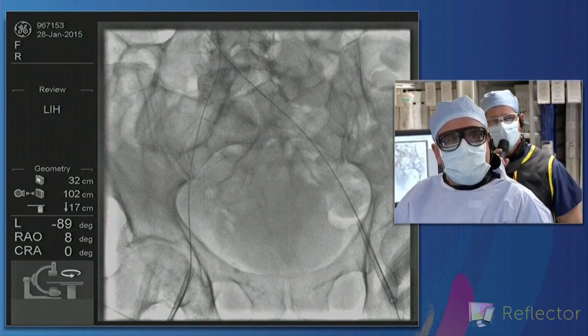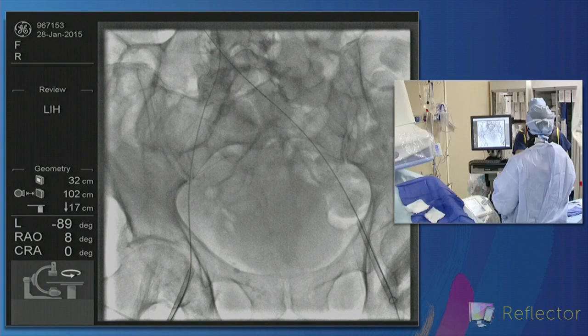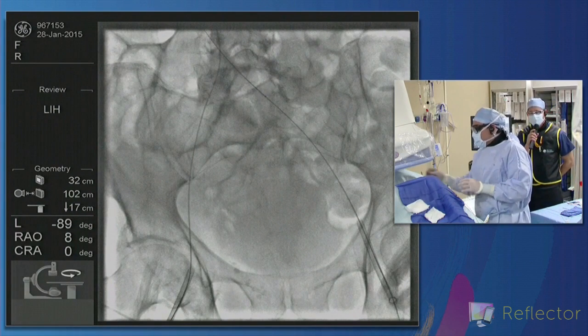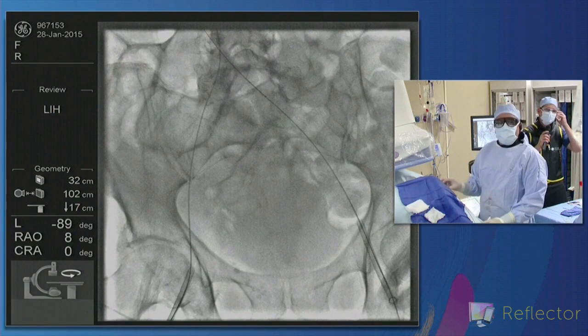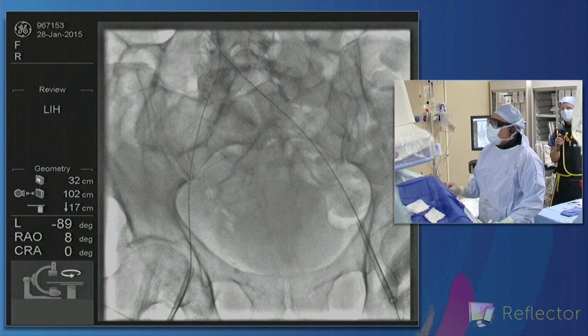Case. So Kevin, how do you arrive at that 2 to 3? What's the basis for that? No, we don't rely on pressure gradients. I have a paper that we have been studying. What we also do, if we think there is something out there, we put in a compliant balloon and see if we have a real stenosis, which we can visualize.